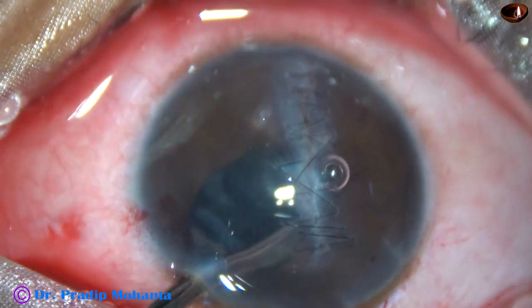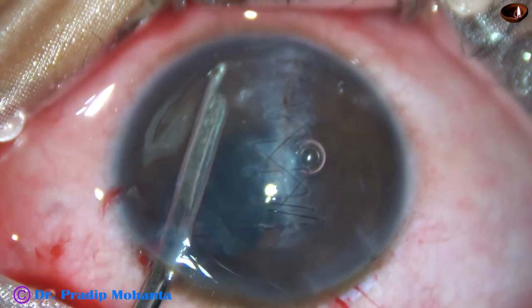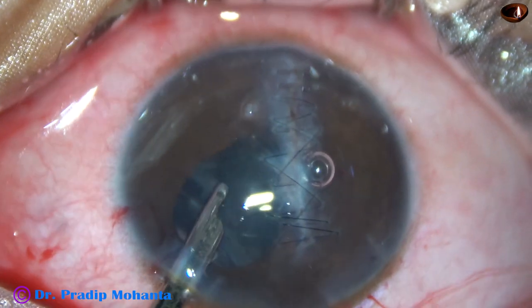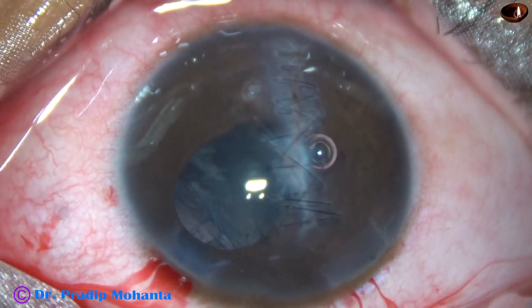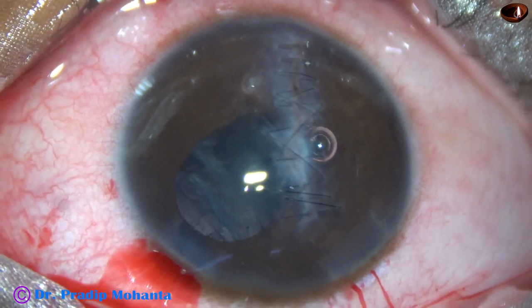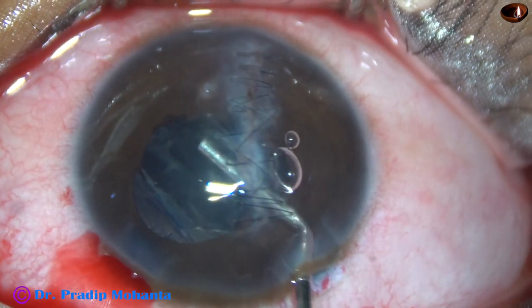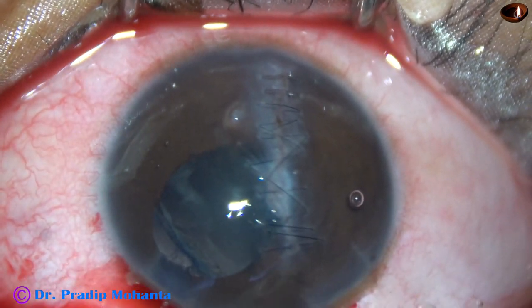Now my plan is to see if the posterior capsule is intact all around. I can see only the upper part of the capsule — inferiorly, I cannot see most of the capsule. So my plan is to apply iris hooks just to visualize the posterior capsule all around.